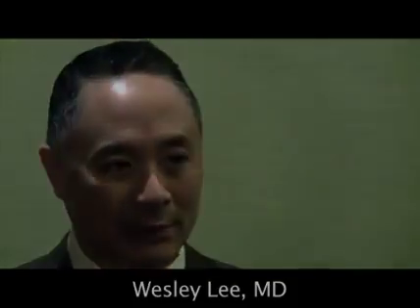My name is Dr. Wesley Lee. I'm from the Division of Fetal Imaging at William Beaumont Hospital in Royal Oak, Michigan. Today I will be talking about the importance of fetal soft tissue assessment.